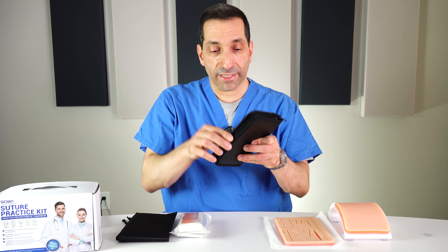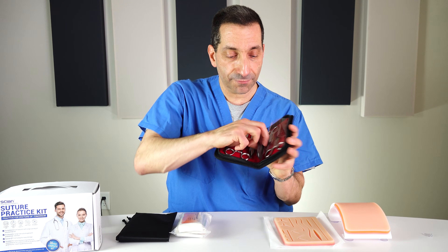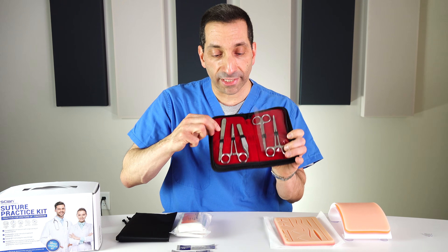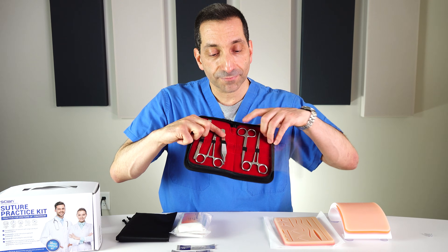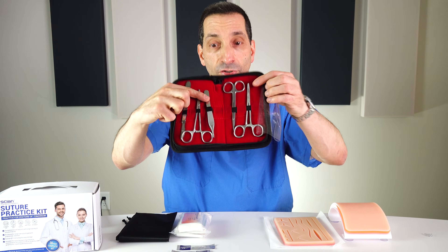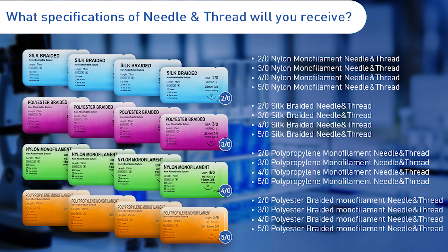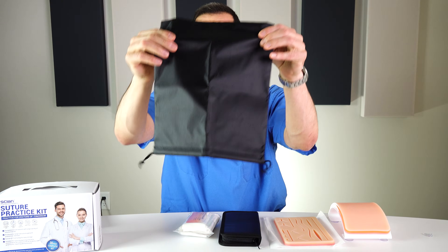It comes with a little kit of instruments: a scalpel with three blades — I've already installed one — a needle driver, Adson pickups, iris scissors, curved hemostats, and 24 different packets of suture of varying sizes and materials, plus a bag to carry it all in.